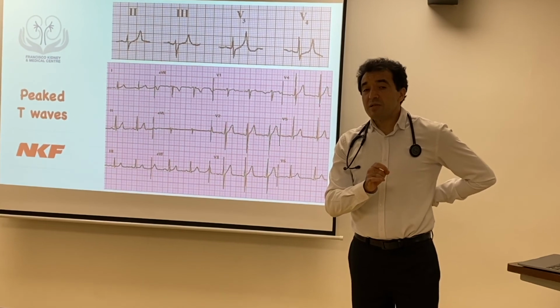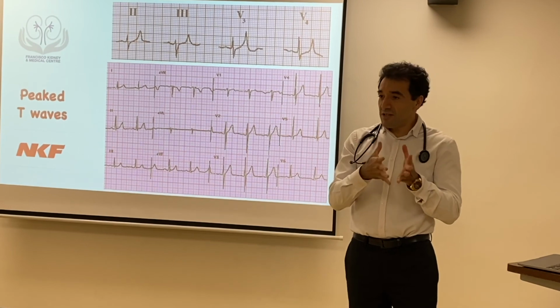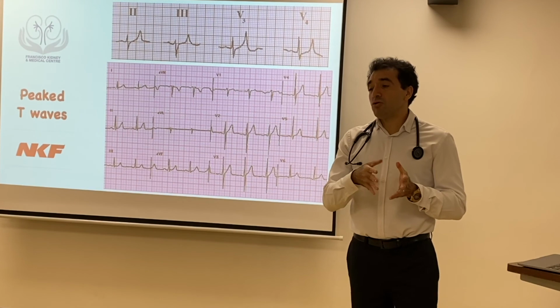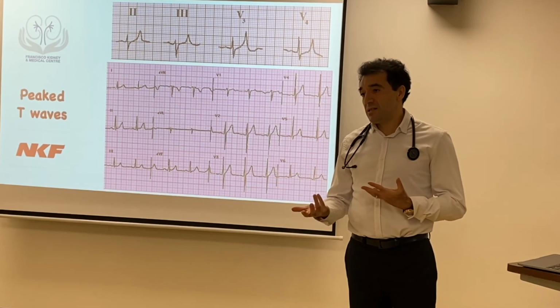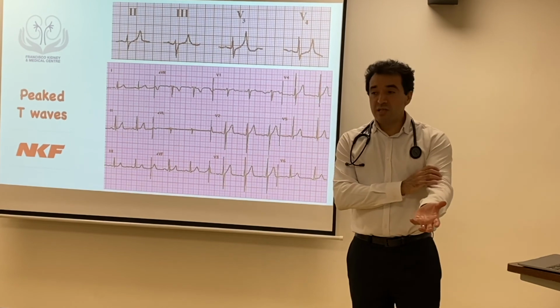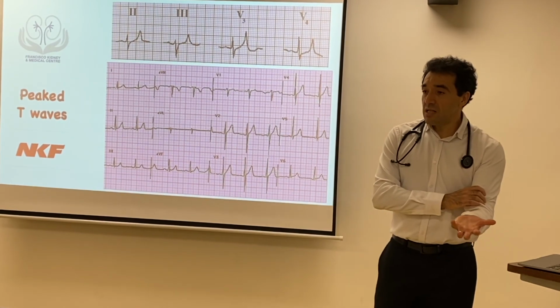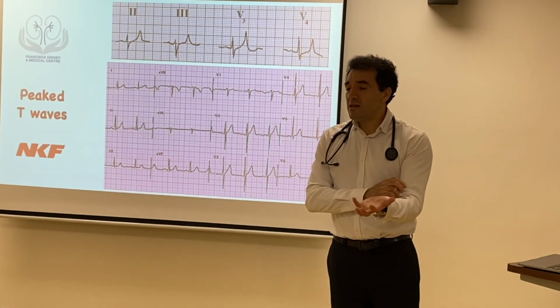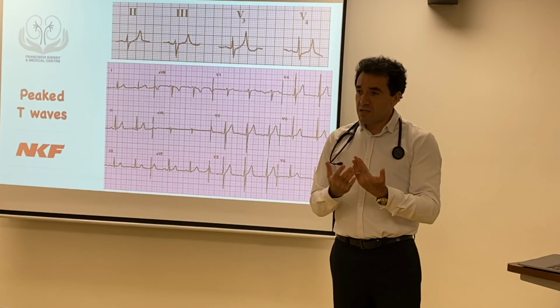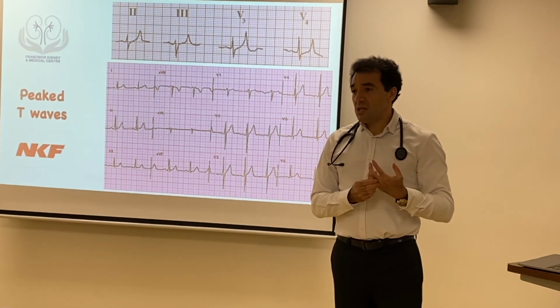Okay, so obviously I'm not sure how accurate the machine is at detecting that, but I will trust that the ECG is probably better. Sometimes the blood pressure is not the same when you do it manually as when you do it on an electronic machine, especially if the rhythm is a little bit funky. That might give you these discrepancies, but then I would trust the ECG more.